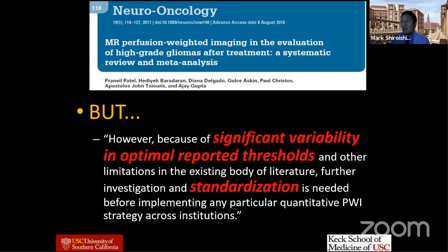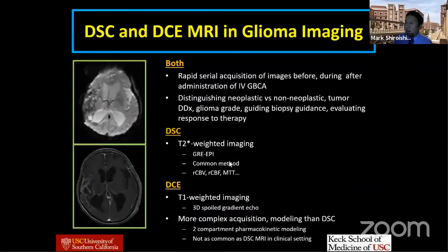If you look at all kinds of other imaging, there are very few universal numbers that are true across the board. Especially with MRI techniques, MRI is so complicated that it's very difficult to establish these uniform numbers. Like blood pressure, for example, there are clear-cut numbers for what is considered normal and what's considered abnormal blood pressure. Those can change over time, but generally you're not too worried about differences in the blood pressure machines. But with MRI, you are worried about the different machines. And we'll talk about how standardization is becoming a bigger issue.